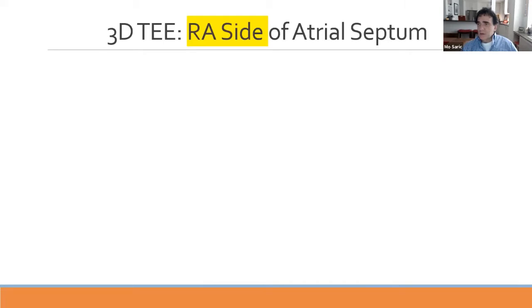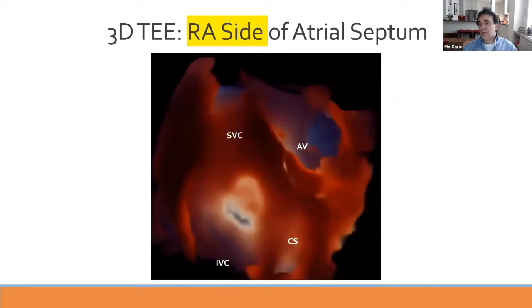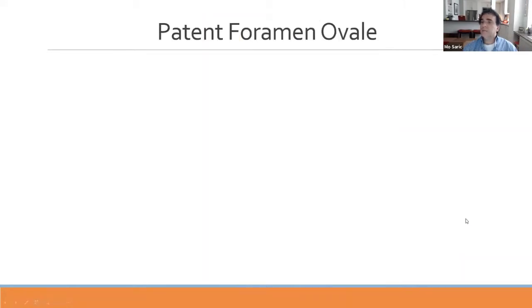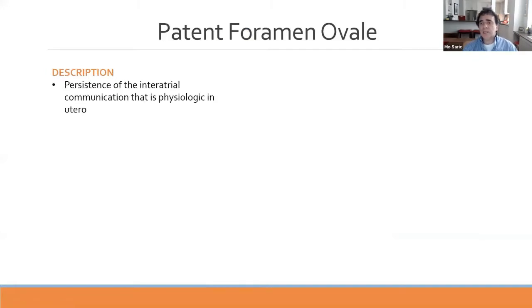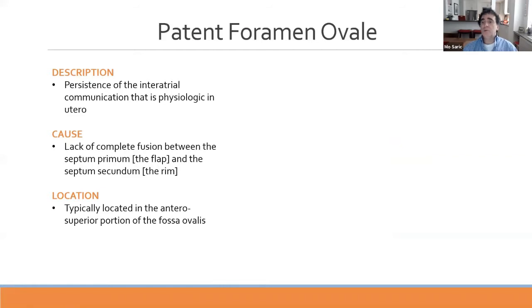Let's look at the atrial septal anatomy. On 3D TEE, this is the right atrial side of the atrial septum showing the fossa ovalis along with the superior vena cava, inferior vena cava, coronary sinus, and parts of the aortic valve. The patent foramen ovale is located in the supero-anterior portion of the fossa ovalis. The fossa ovalis is quite thin relative to the rest of the septum on transillumination. Patent foramen ovale is a persistent atrial communication that is physiologic in utero, caused by lack of complete fusion between the septum primum (the flap) and the septum secundum (the rim), with a prevalence of about 25% of the adult population.